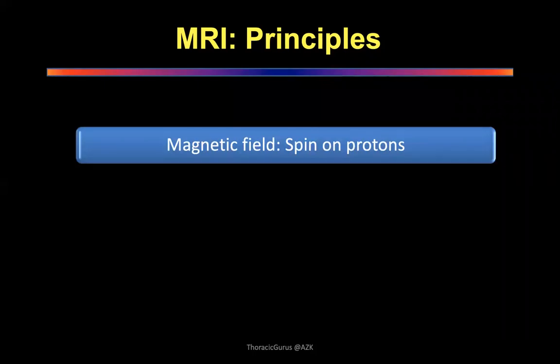So the proton is moving by itself, and the moment the magnetic field comes in, the proton moves to align itself to the magnetic field. That is a normal reaction. Any magnet moves to align itself to the north-south pole of the bigger magnet, okay?